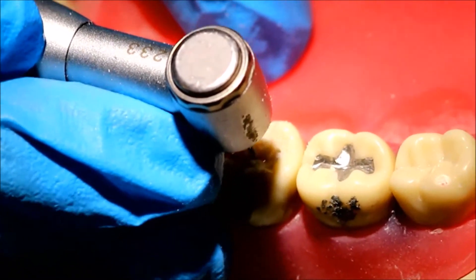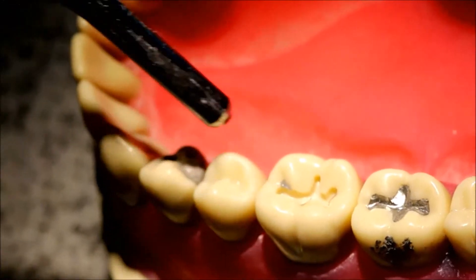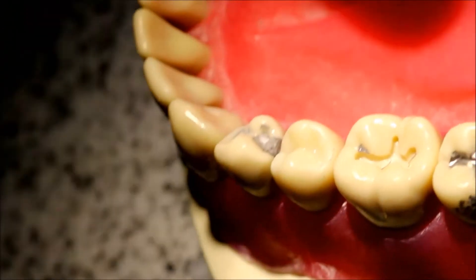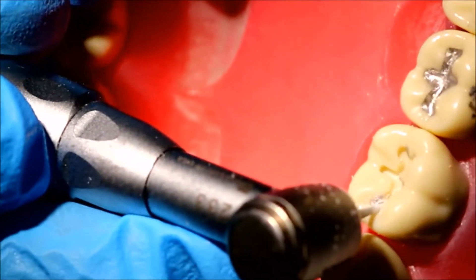Part of using the 245 in the low speed will also make sure that any surface roughness is eliminated. Once you get to your dovetail, you have to tip the burr ever so slightly to make the dovetail divergent, as you can see right now.